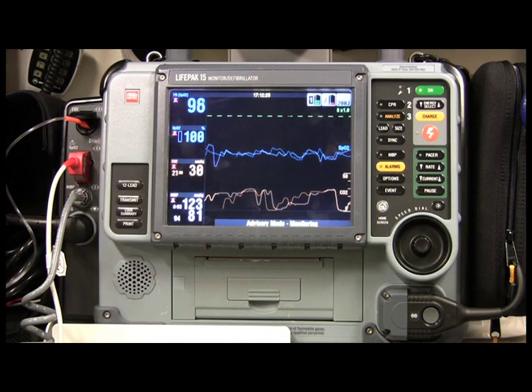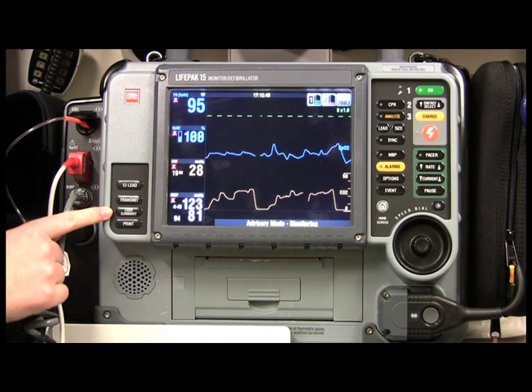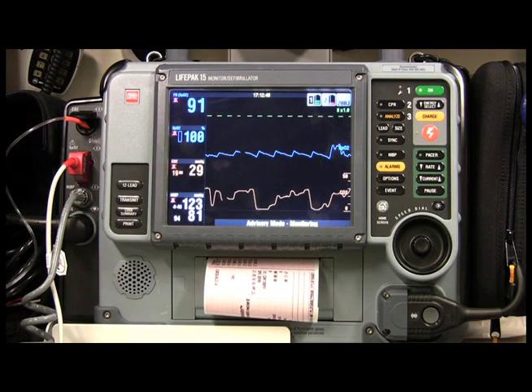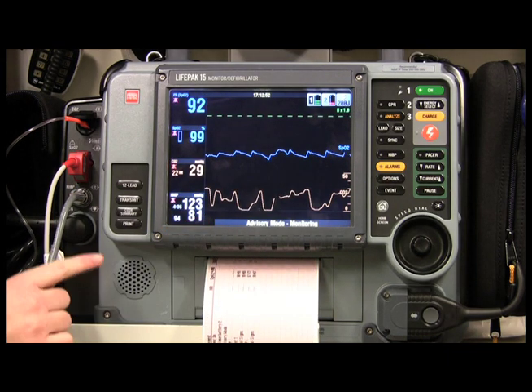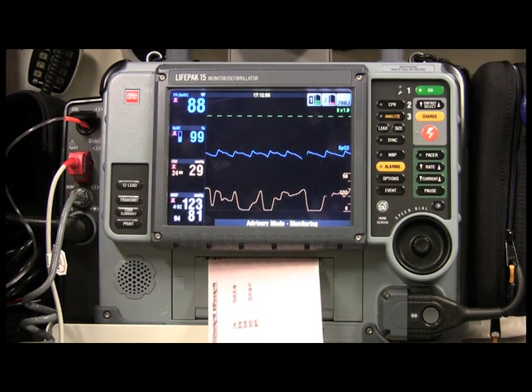Now let's say I have finished my transport and I want a code summary of all the vitals that I took. All I do is come over to code summary and it starts printing out. It's also going to print out the waveform, but I'm going to stop it right before that because I don't want to waste the paper.